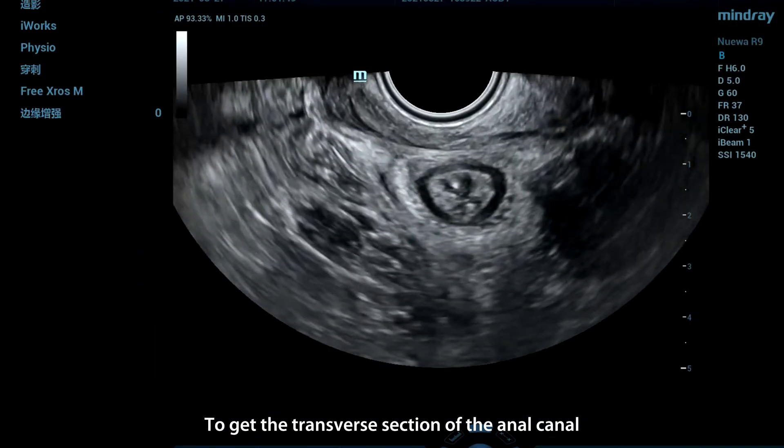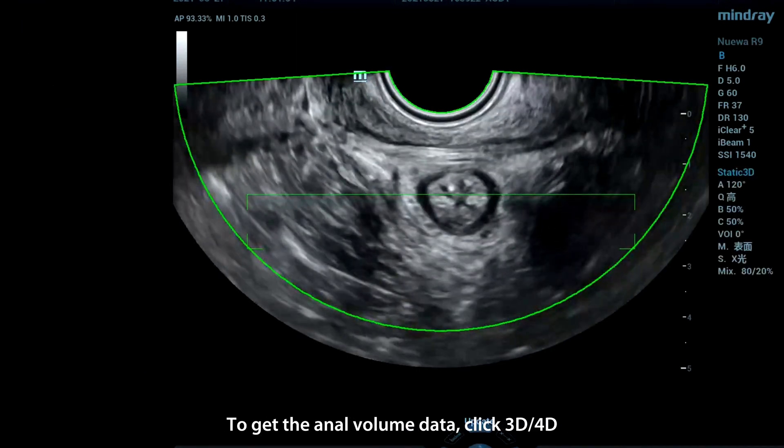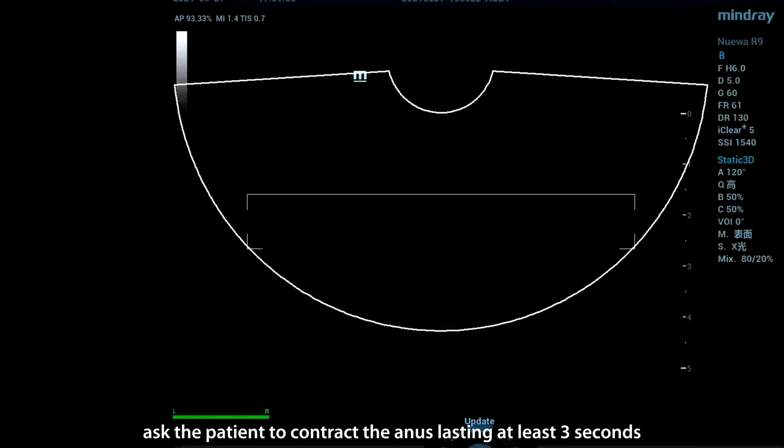To get the transverse section of the anal canal, turn the probe 90 degrees counterclockwise. To get the anal volume data, click 3D-4D and ask the patient to contract the anus lasting at least 3 seconds.